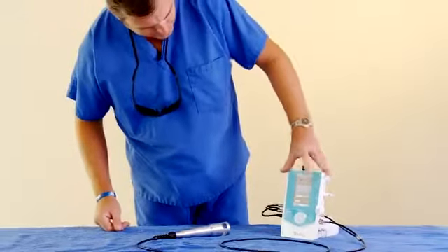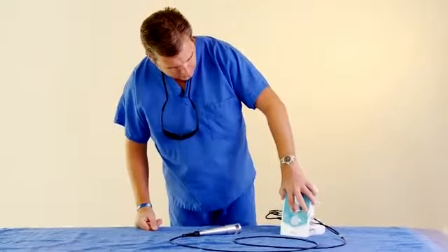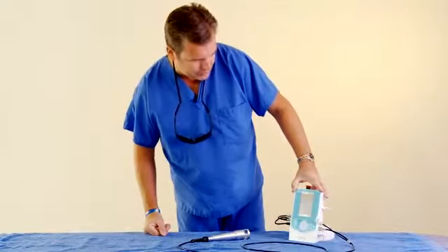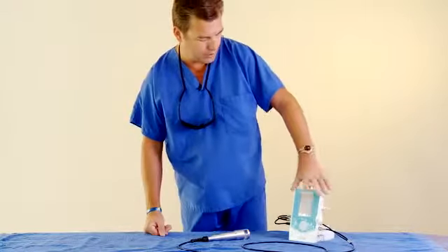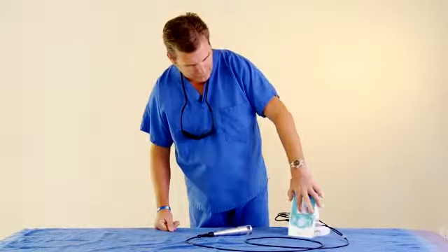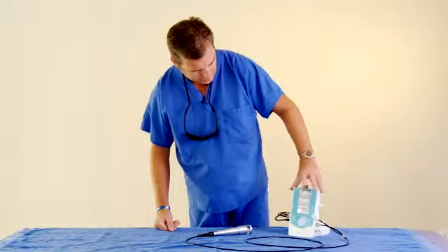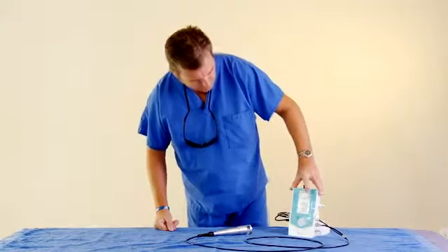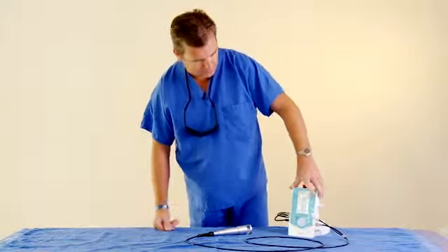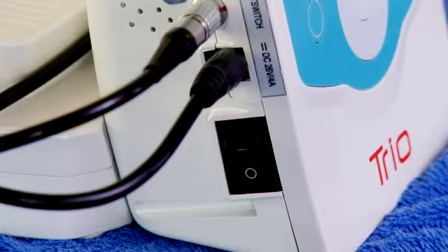Some of the other options are timer, which you can have a timer. And this is just your information on your laser. If you ever have a warranty claim, the info key gives you all the information, serial number, and that. And if you ever get in a situation where you're not sure where you're at, go back to protocols. It'll take you to the main menu. When you're finished with the laser, you can turn it off with the finger switch here.